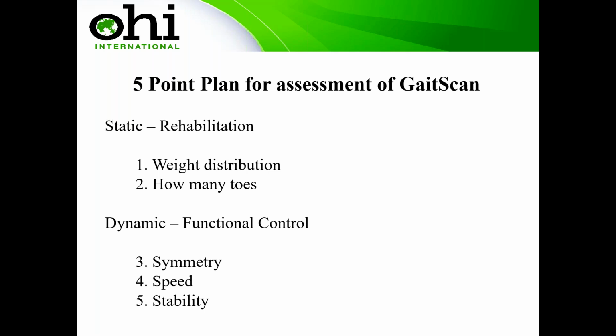The 5-point plan was developed over here in Europe. We've been using it for the last probably 18 years, and it was developed really because of the way, when I started with the company, I worked myself. It's a simplistic way of looking at it, which allows our patients to really become invested in the treatment because they also understand. And when they understand, they're more likely to become invested in what we're trying to achieve.